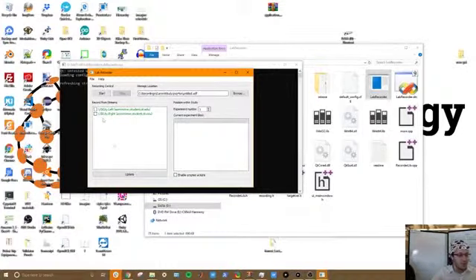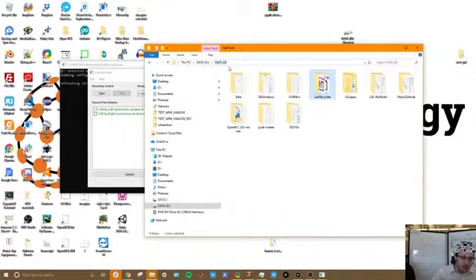So I could record those if I wanted to, but right now I'm not going to. But you can notice that my EEG is currently not streaming. Well, the problem is the EEG is not directly connected to Lab Streaming Layer. We have to create our own stream.